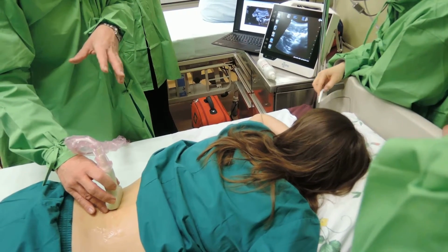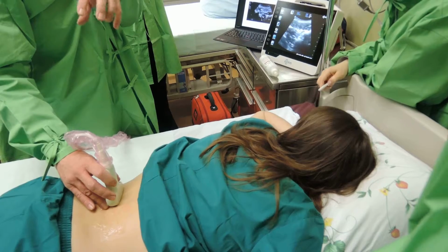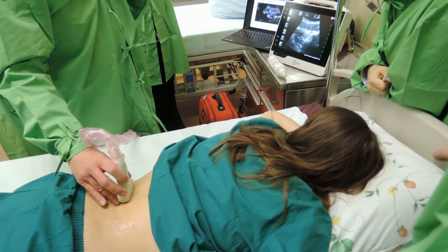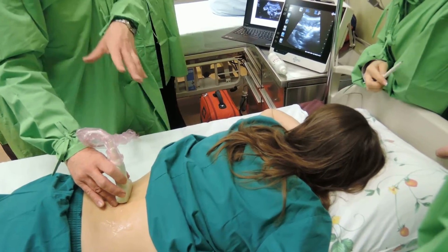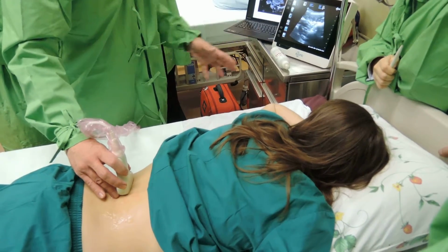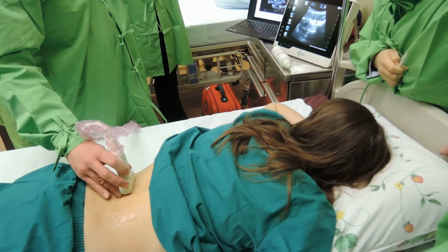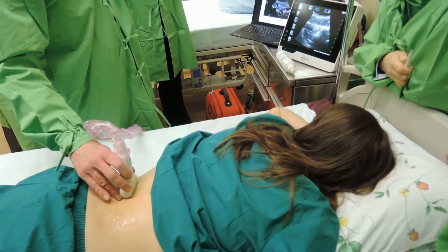She is an optimal model. No? She is simply beautiful. It becomes difficult in an obese person to see the root, but in persons such as her, it's easy even to find the root. In obese patients it is hard to visualize the root with ultrasound, but our girl is beautiful inside and out, and we can see everything on her.